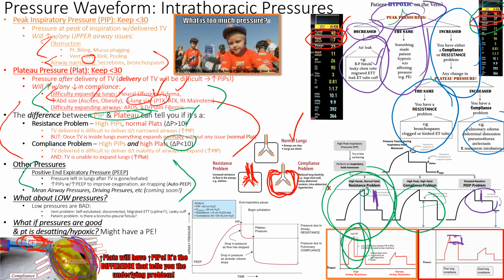And what about low pressures? We said were bad. Obviously, there's probably a disconnect of some sort. Again, if your pressures are all good, but you're really, really desaturating and hypoxic, it might be a PE that's going on. There's something else at work.